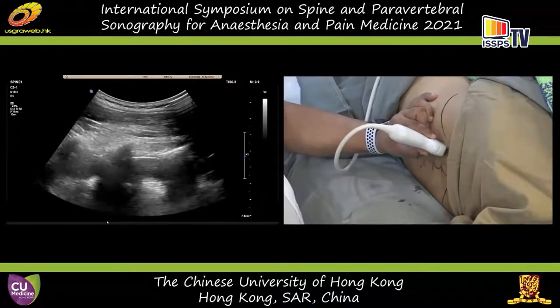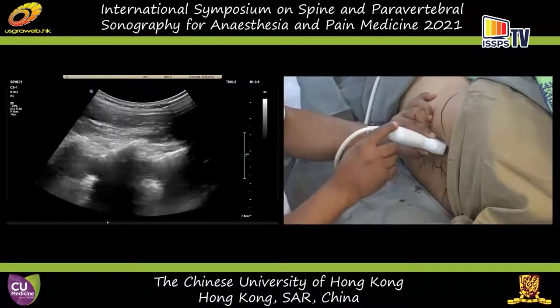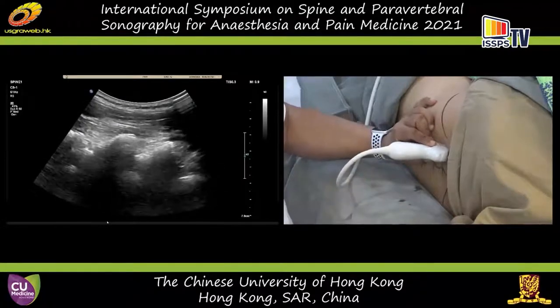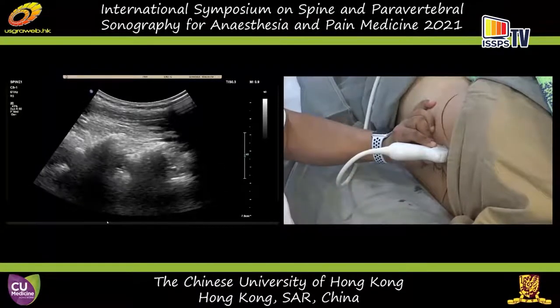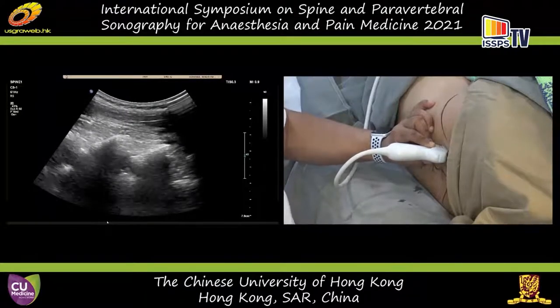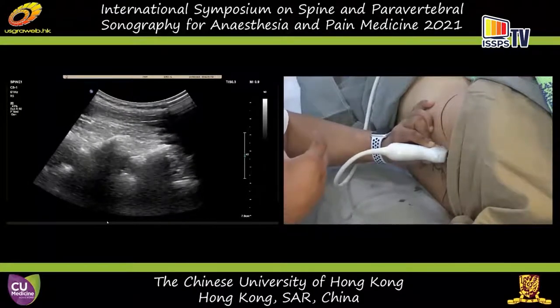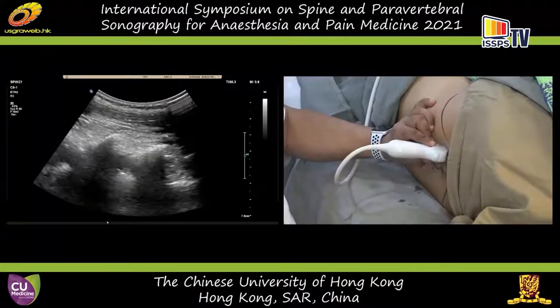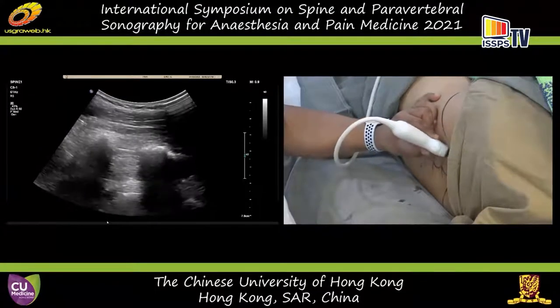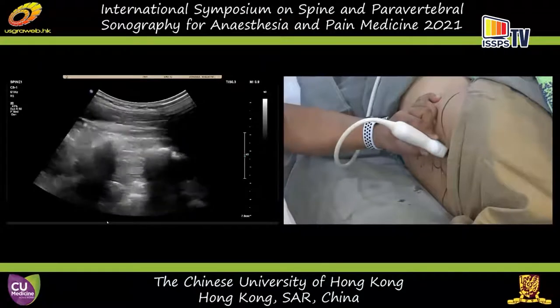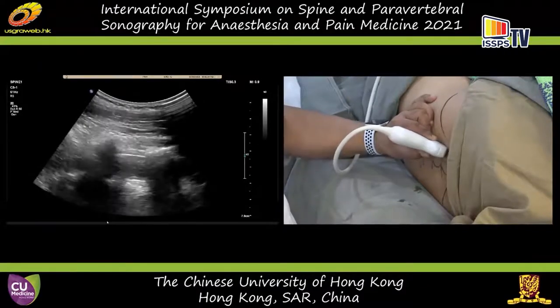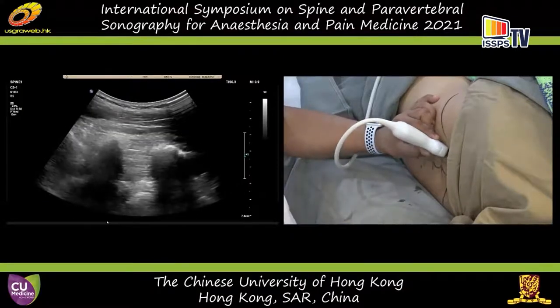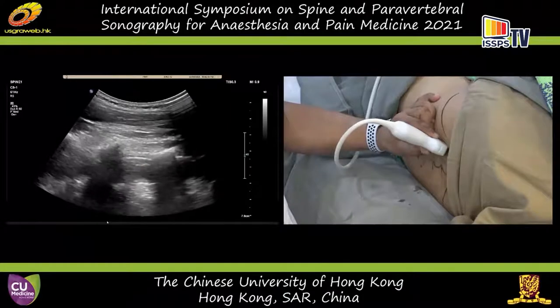It is a paramedian view. If I just did a true paramedian sagittal scan, the image is not as good — you are seeing only a narrow section of the thecal sac, probably only looking at the lateral sulcus of the thecal sac. In contrast, when you tilt, there is some slide involved. Remember, it's not only a case of tilting — there is no absolute number or degree. You have to tilt and then slide until you get a good view of the posterior dura.